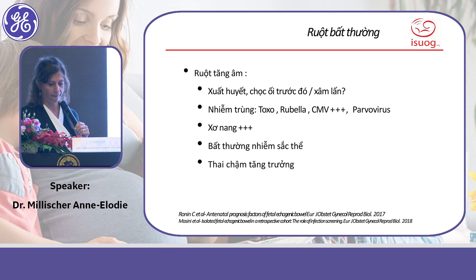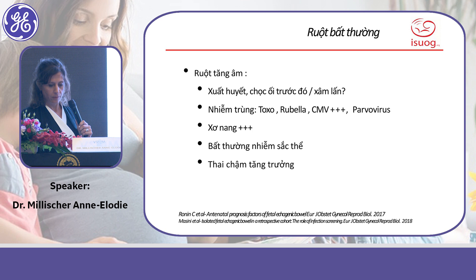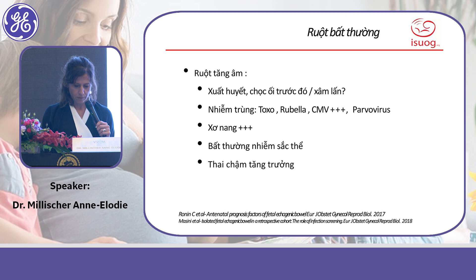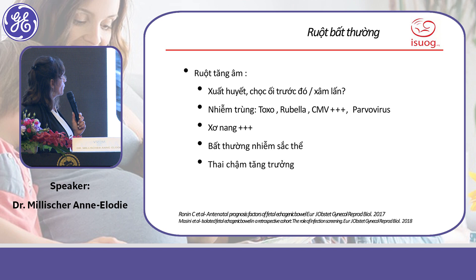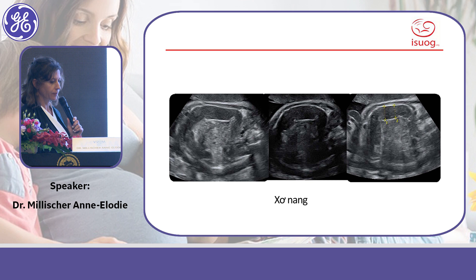When you encounter a case of hyperechoic bowel, pay attention to the following causes: first, hemorrhage or bleeding; then infections, especially fetal CMV infection. Cystic fibrosis is also very commonly associated with hyperechoic bowel, as are chromosomal anomalies and intrauterine growth restriction. Here is an example of cystic fibrosis with dilated bowel and hyperechoic appearance.